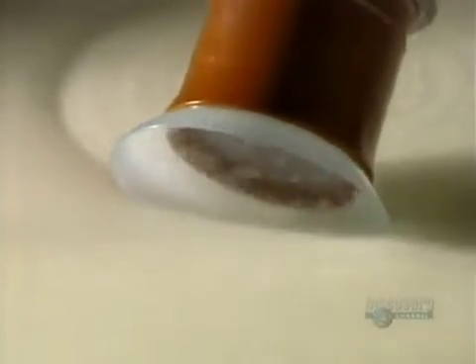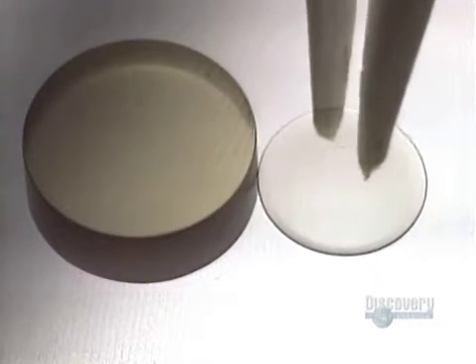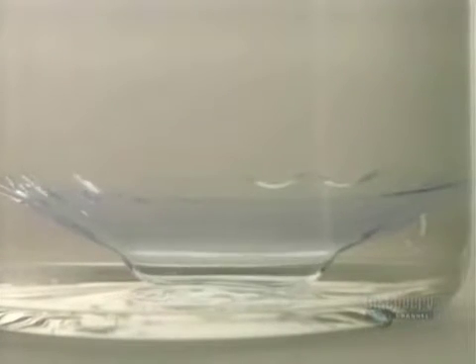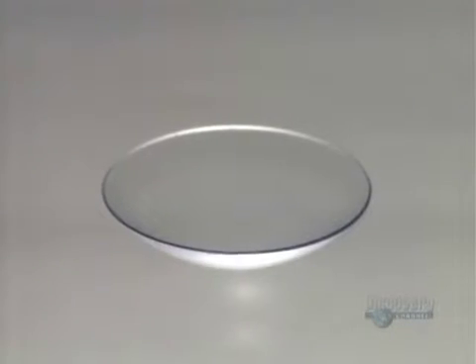A technician then polishes the rims of the lens. The polymer is then hydrated to make it flexible. Lenses remain immersed in a balanced pH saline solution for 24 hours. The lens becomes engorged with liquid and expands, reaching the desired proportions.